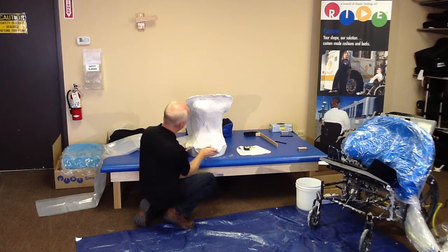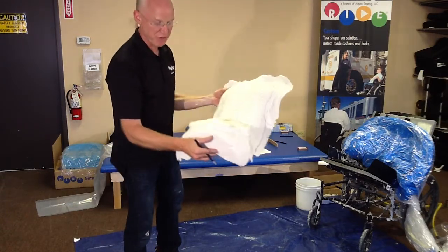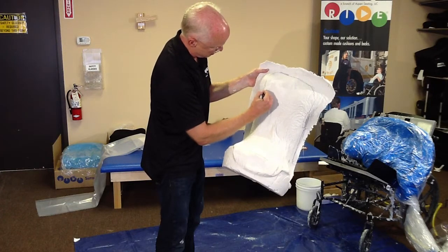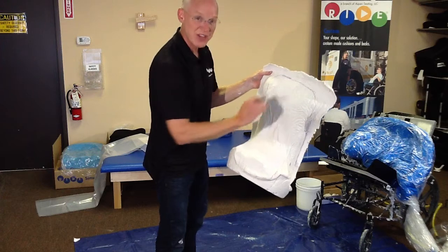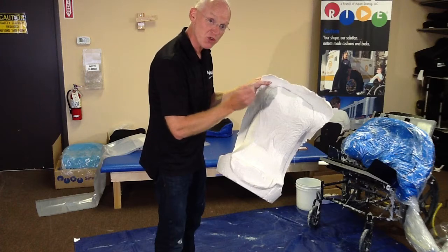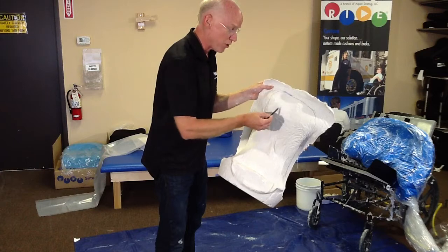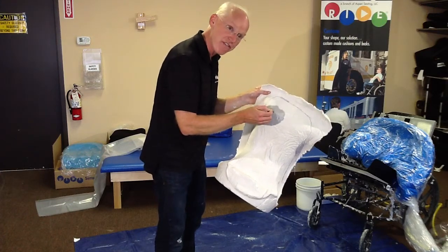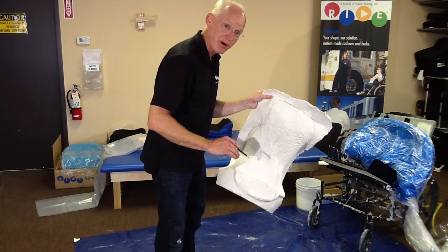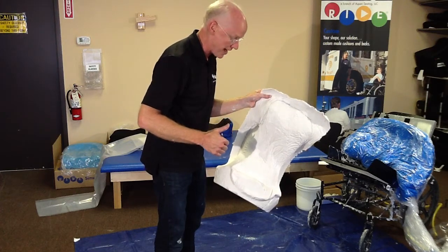What you want to do is draw exactly how you want the back support. Now with us capturing, you see the reference for the simulator pan. And you can see I've drawn my back shape, so I'll know exactly where those trim lines need to be cut. It's very important you get good references for these trim lines so we get the back exactly the dimensions you want. We build the back model directly off of this shape. So we're going to translate that trim line you give us through the whole production operations. We'll do it exactly as you give it to us. Give us good information, you're going to get a real nice, accurate back support.